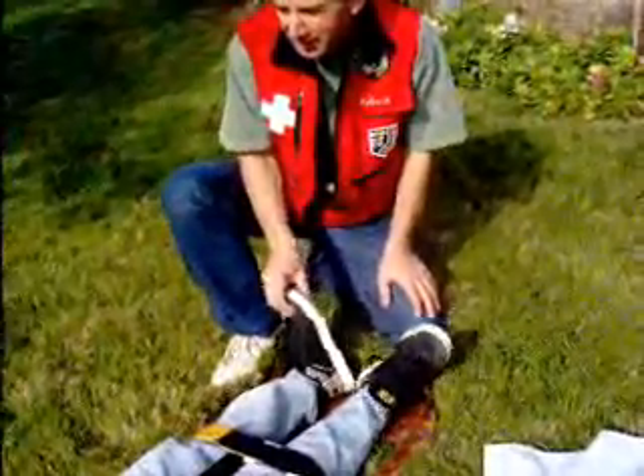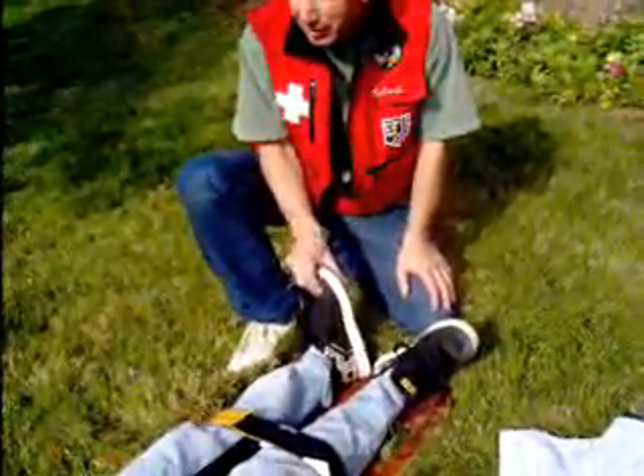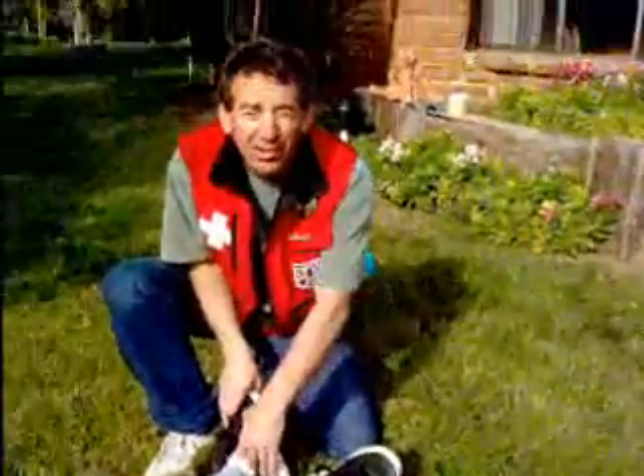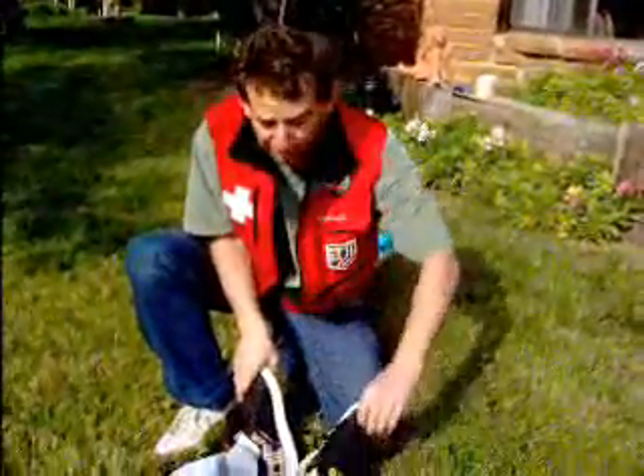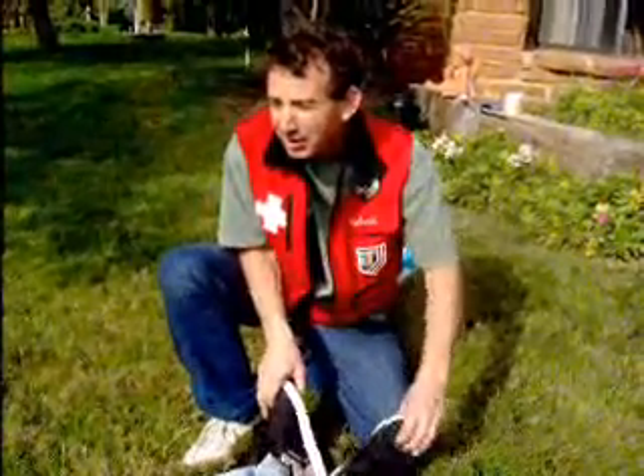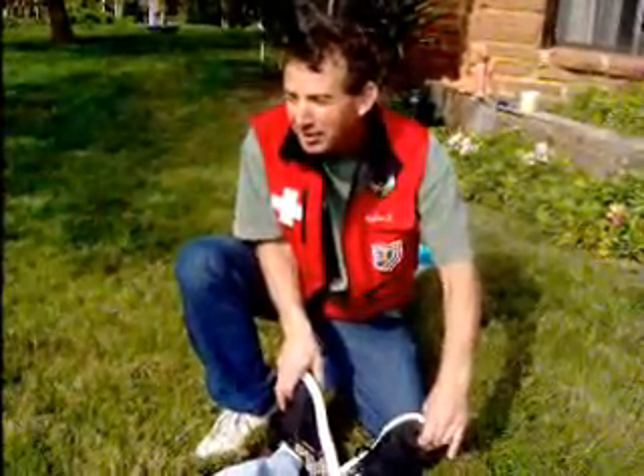Now she's completely secured down. I've splinted her — what do I have to do? I have to check her CMS again. Can you move your feet? Move your toes. Any tingling? No. Which toe am I touching over here? The pinky. Okay, CMS checked.